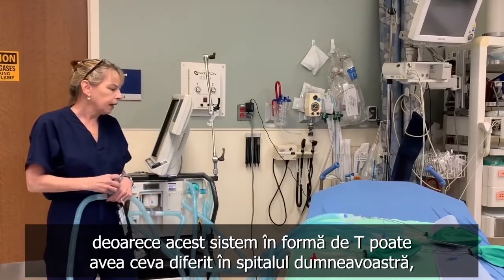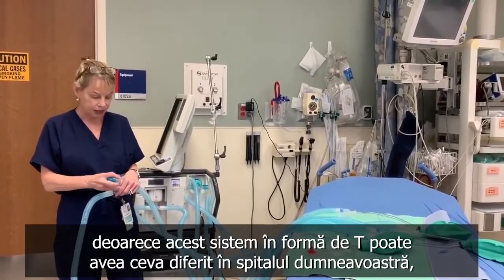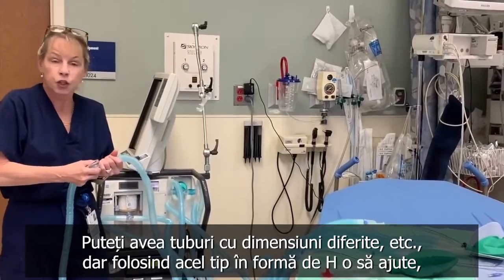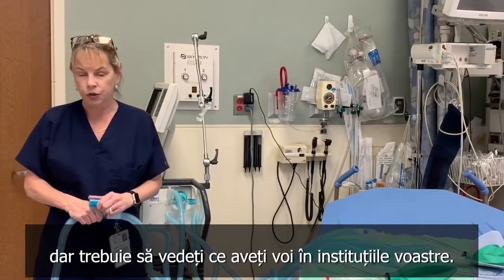I will tell you that there's lots of different materials that you can use to configure it, such as a T-system like this, and your hospital may have something different, but if you simply put it together the way I showed you, you may have different size tubes, etc., but using that type of H formation will help, but you have to see what you have in your institution.